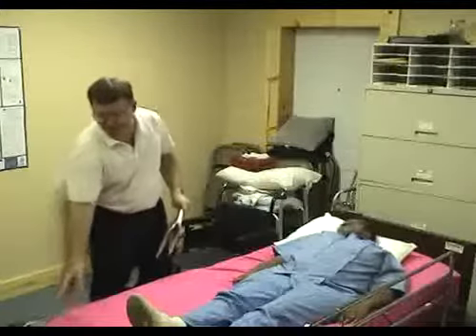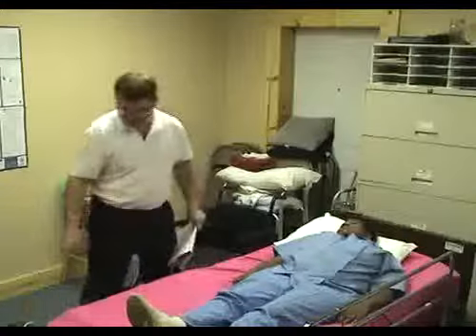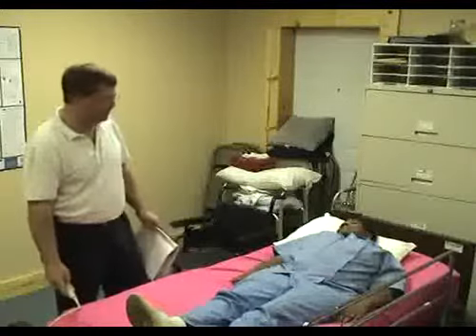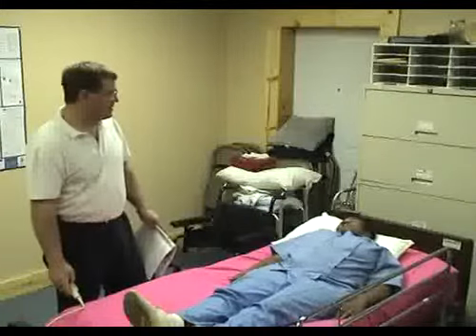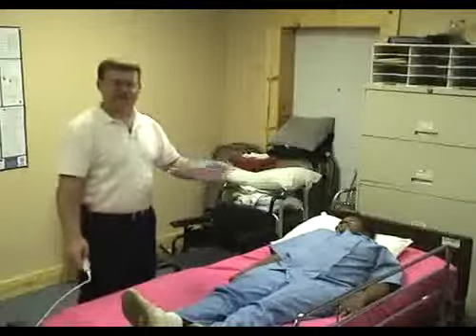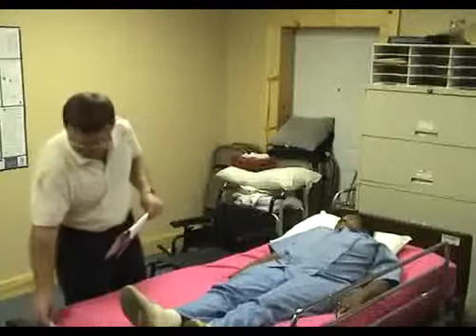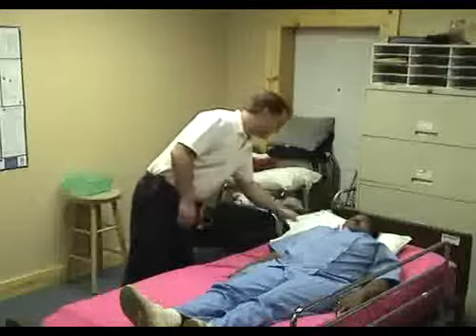It's easier to go from a higher. Yeah, Jim, the bed's off. Oh, you know, that's because there's that container underneath. It's just not allowing us to go down that side. This is an automatic turn bed. Rolls you side to side. That's better. Okay, let's cut this in here.